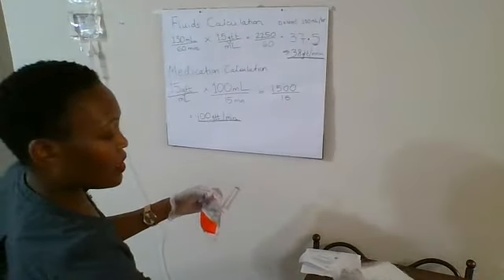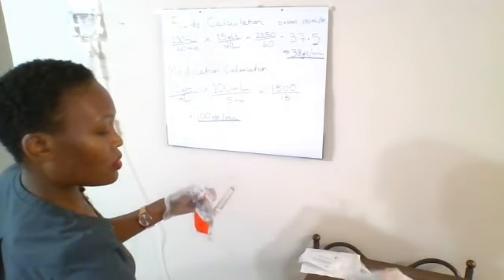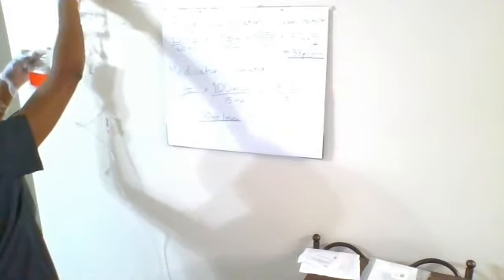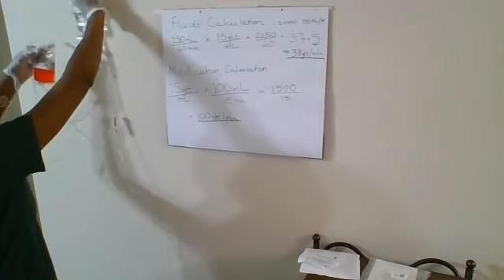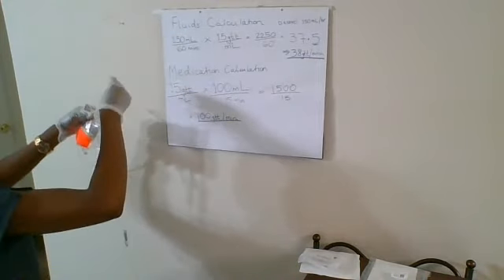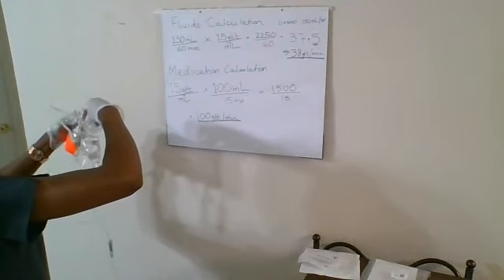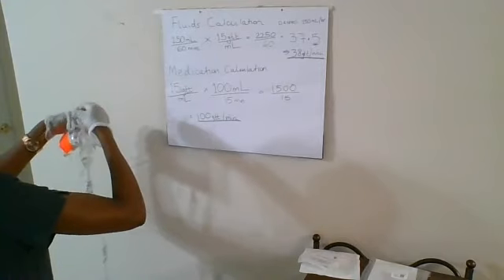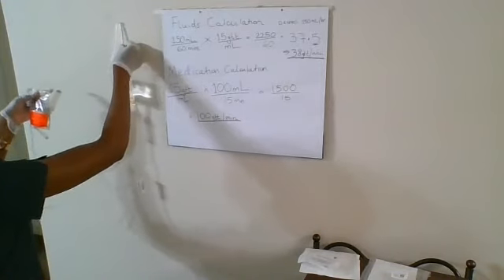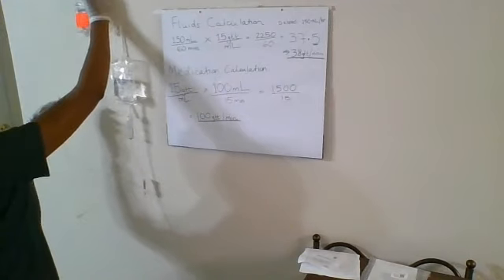And I will use the hook that I have, the loop, to lower this bag, the IV fluid bag. I'm going to use that to lower it below my medication, like so. And then I'm going to put this up here.